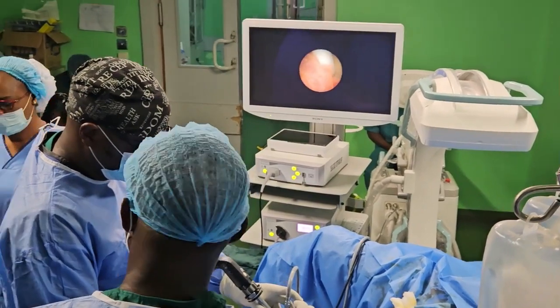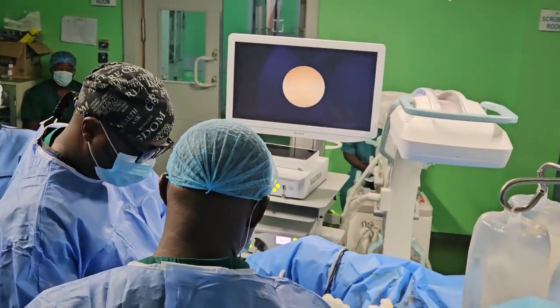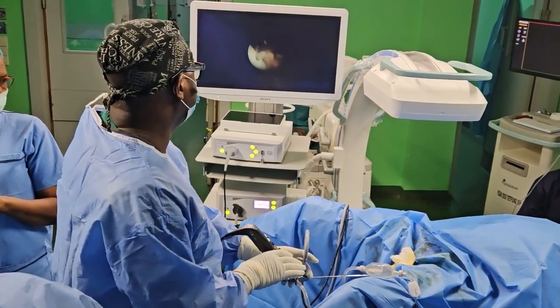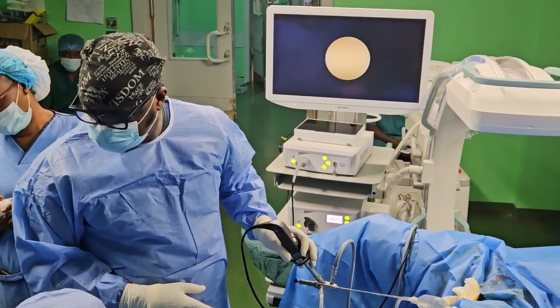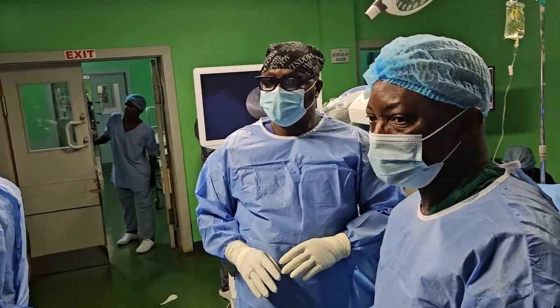What's the reason for this pre-stenting? Is it just to release obstruction, or is it for the PCNL? The one we use to put in the ureter, just two prongs. That bypass here. For PCNL, even for everything.